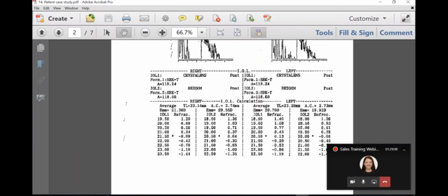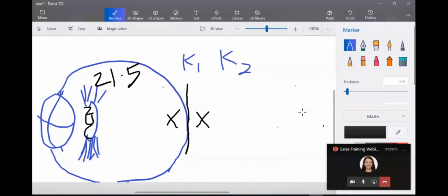So when we are using a standard monofocal lens, we're not correcting the astigmatism as in bringing the two focal points into one point, but we are using the spherical equivalent to get the best result without using a toric IOL. Like we said earlier on, you can use the spherical equivalent effectively to correct the vision provided the astigmatism is not more than 0.75 diopters.